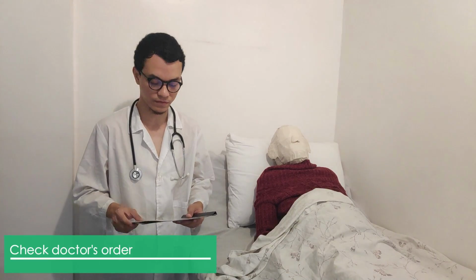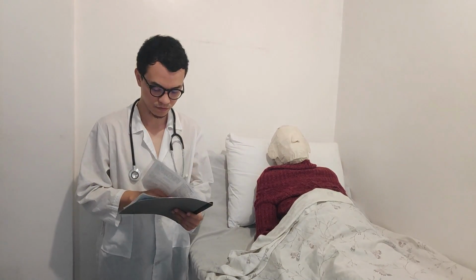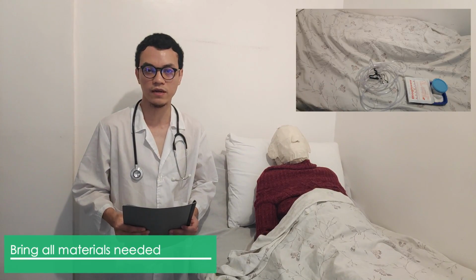Hi everyone, today I am going to demonstrate how to administer oxygen by oxygen mask. So the first step is to check the doctor's order. Next is bring all the necessary materials needed on the bedside stand or overbed table.